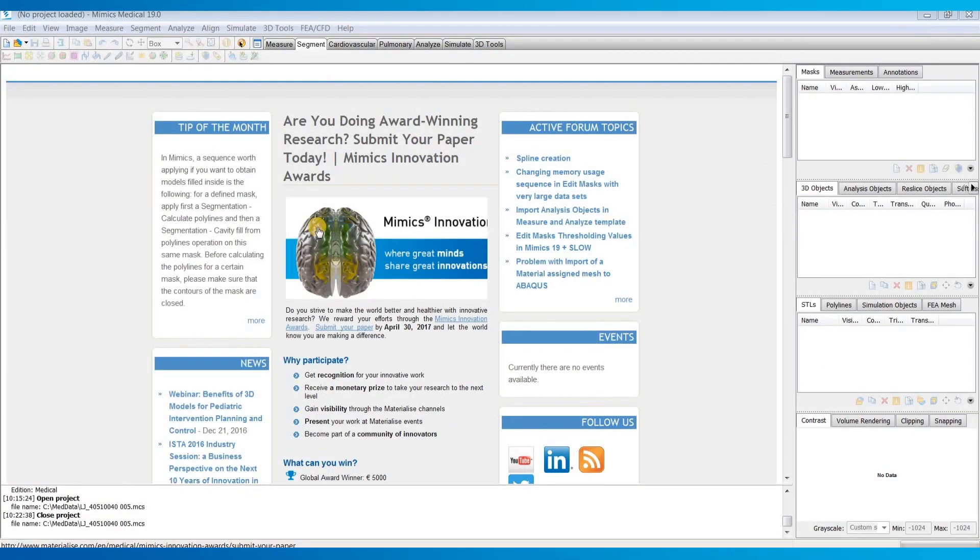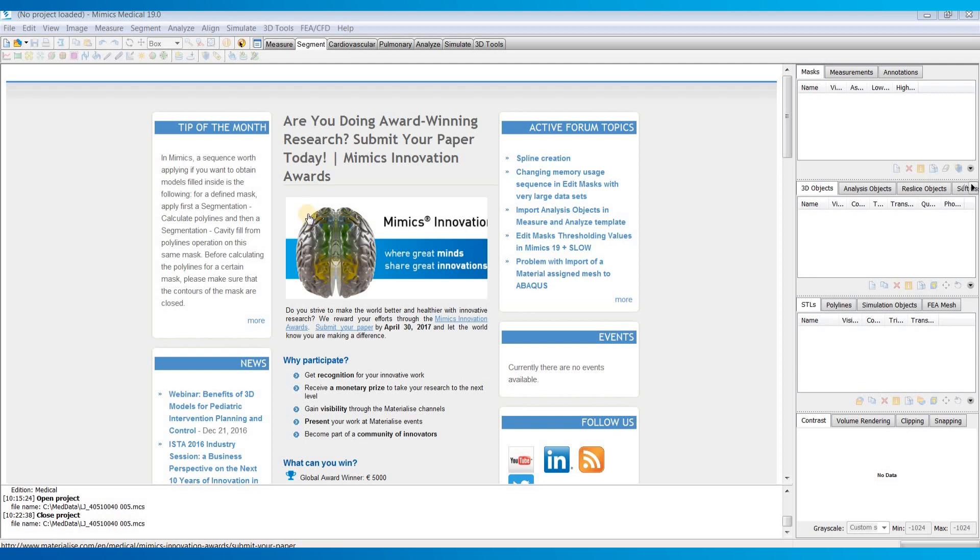Hello, in this video I will give a brief introduction to Mimix to help you get started with the software. I'll be covering how to import your DICOM images into Mimix, go over the layout of the interface, as well as how to navigate through your images. For this video I'll be using version 19 of the software which was released in 2016.